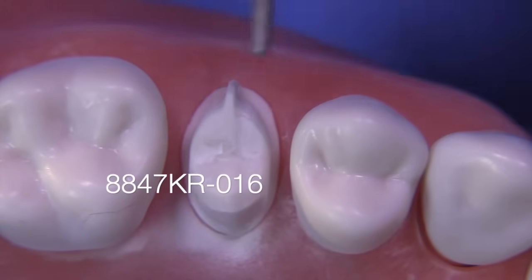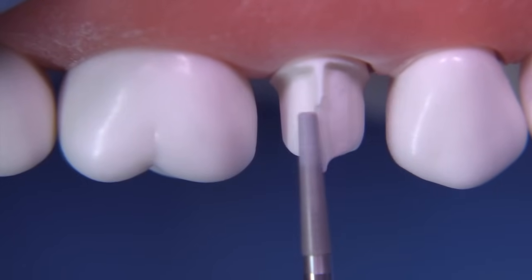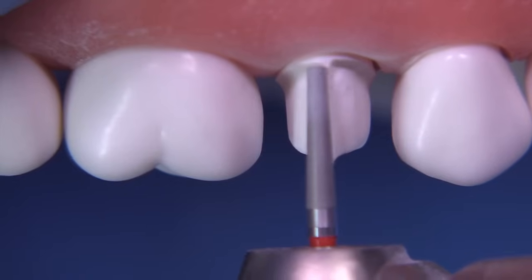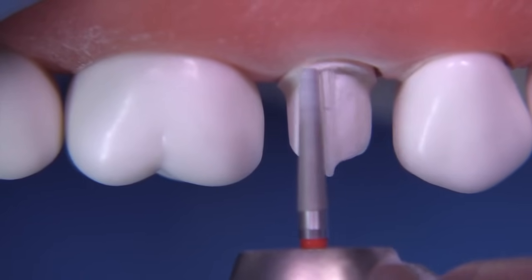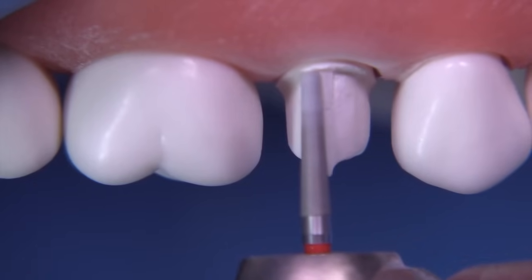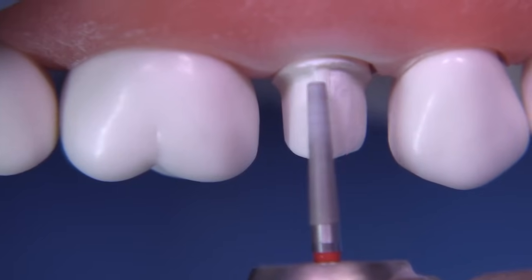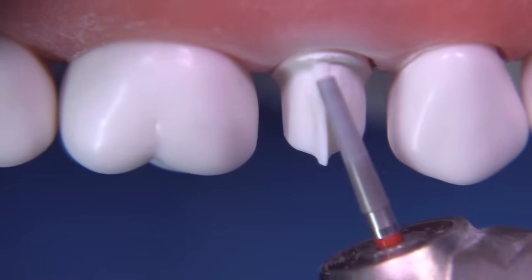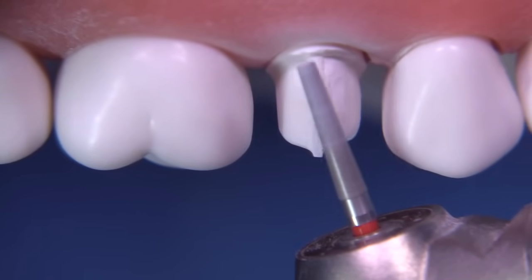The 8847 KR 016 is a diamond analogous to the 847 KR, and since I'm refining the facial and want to make it as smooth as possible, I want to use a 30-micron grit diamond rather than a coarse diamond. Sometimes you can use the bur obliquely to remove irregularities.